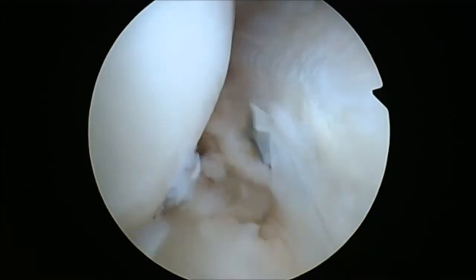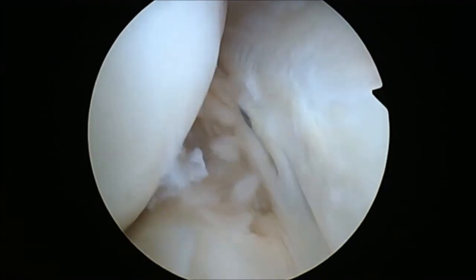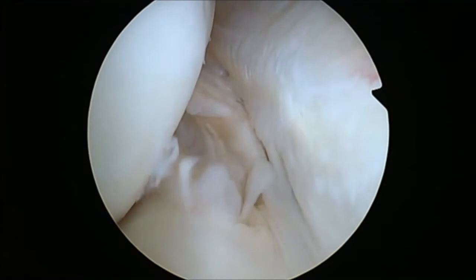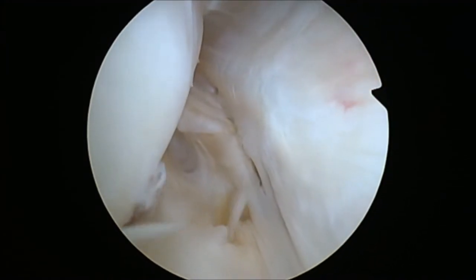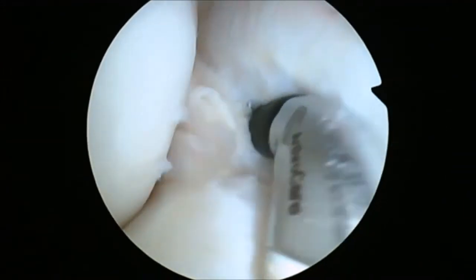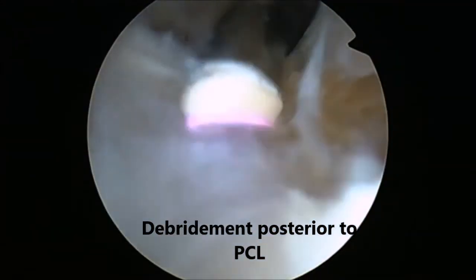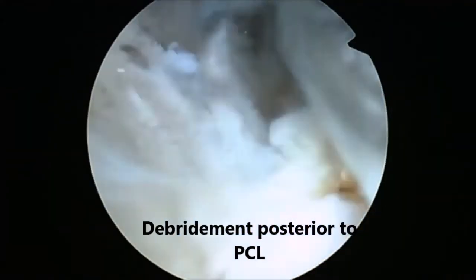This can be easily done with no risk to the fibular nerve or any other structure located in the posterolateral corner. With a clear view of the posterior structures of the knee, a radiofrequency device is introduced in the posterolateral portal, starting the debridement right posterior to the PCL.